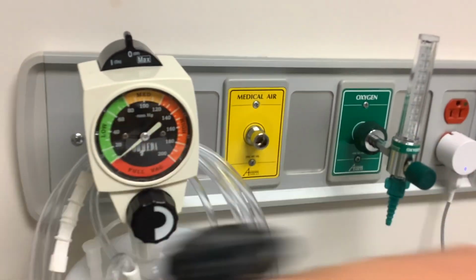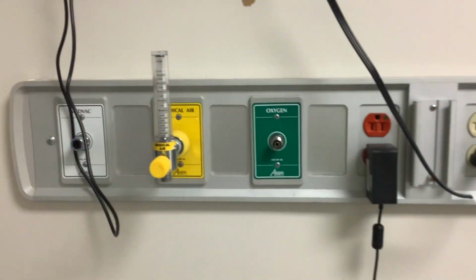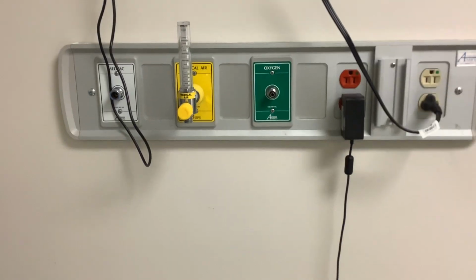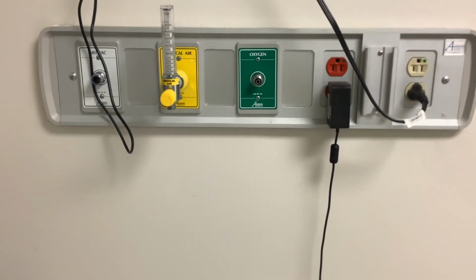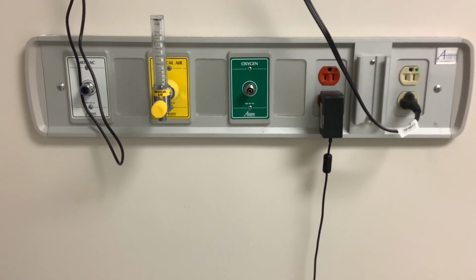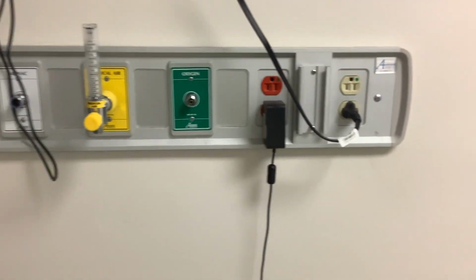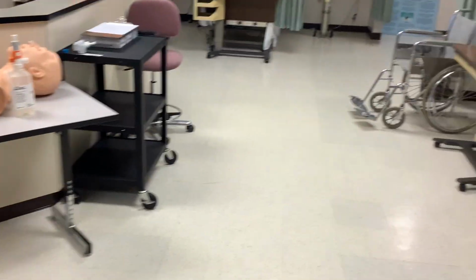Definitely make sure that when you're wanting to provide supplemental oxygen to an individual, you are utilizing the oxygen flow meter. And again, this is a diameter index safety system. It works with less than 200 psi, but it is coming from a line system hooked up to a pressure reducing valve that takes the high pressure and reduces it down to our working pressure of 50 psi. So that's going to be important to remember moving forward.